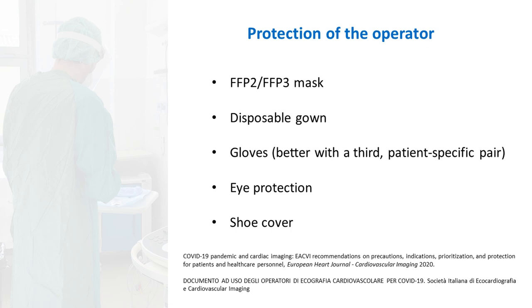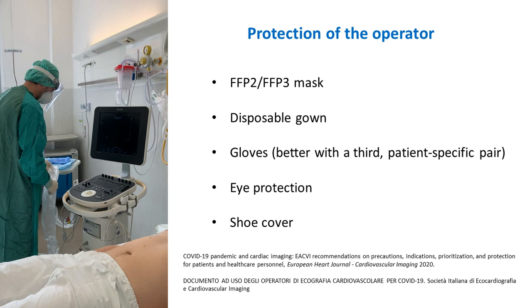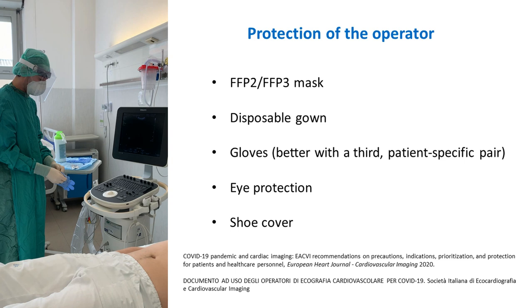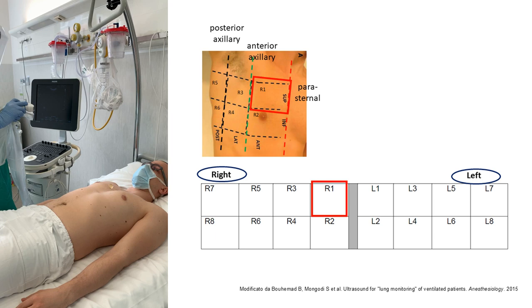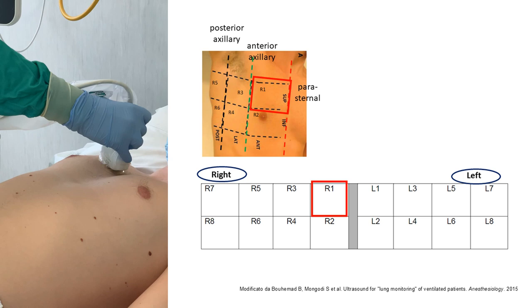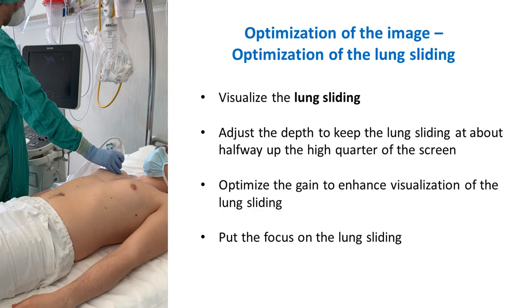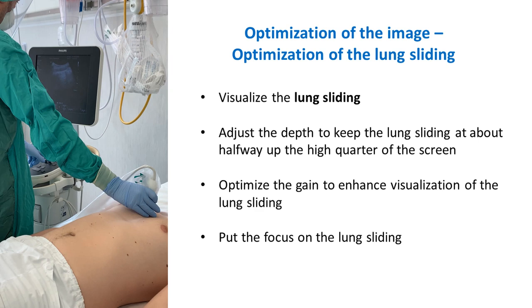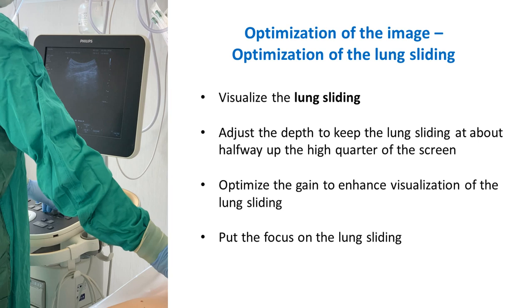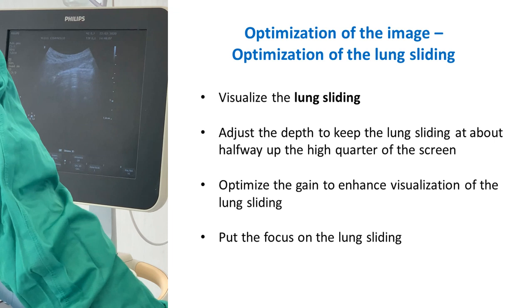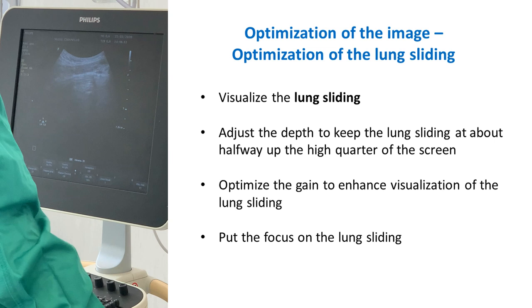The operator should be properly protected as indicated by recommendations and specific documents. To protect the operator, it is advisable to use a third pair of gloves, which will be discarded at the end of the exam. Let's start with the right anterior thorax upper part. We place the probe on the skin and then optimize our image. The pleural line is our reference — we should be able to visualize it with its lung sliding. We should optimize the gain to better visualize the pleural line and lung sliding. The depth should be adjusted so the pleural line is at about halfway up the highest quarter of the screen. If possible, the focus should be positioned at the level of the pleural line.